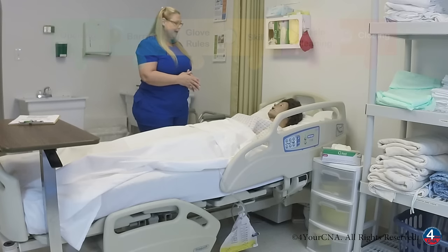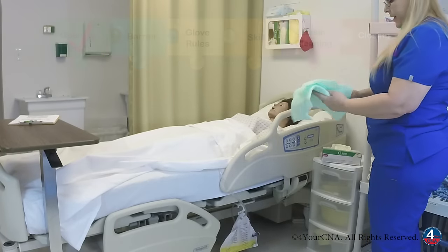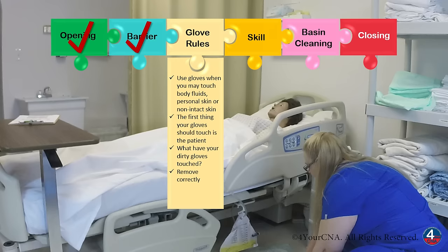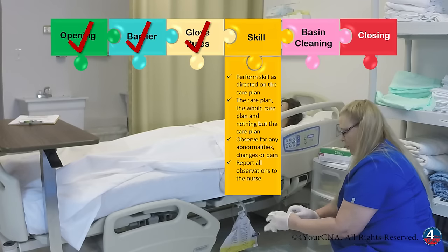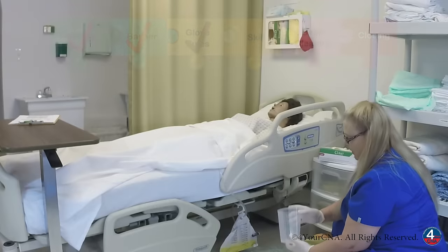I'm going to close your curtain, wash my hands, get my supplies, and I'll be right back. For this skill, I'll need a barrier, which I'll place on the floor under the drainage bag. I'm going to need a set of gloves and a triangular graduate container.